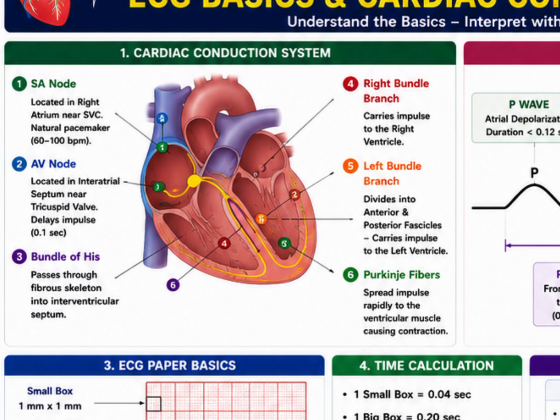ECG stands for electrocardiogram. It is a graphical recording of the electrical activity of the heart. Remember, ECG records electricity, not mechanical contraction. Electrical activity occurs first, mechanical contraction occurs later. So ECG tells us what the electrical system of the heart is doing.